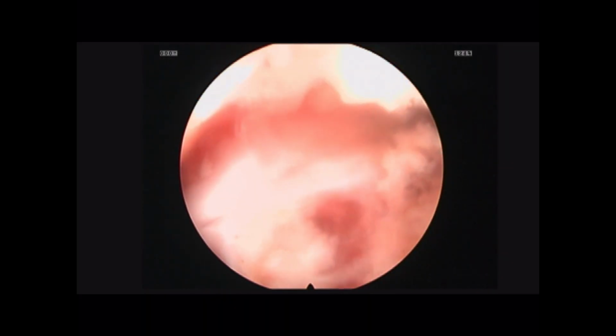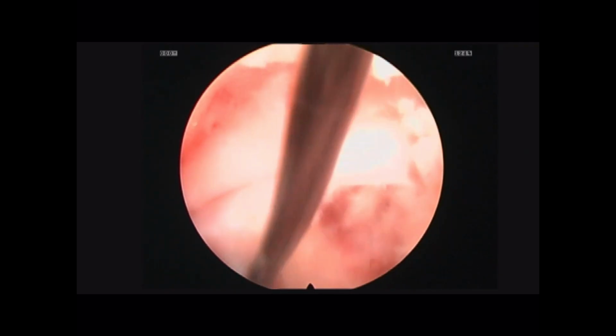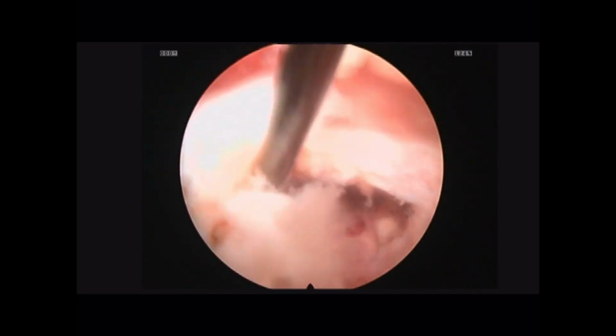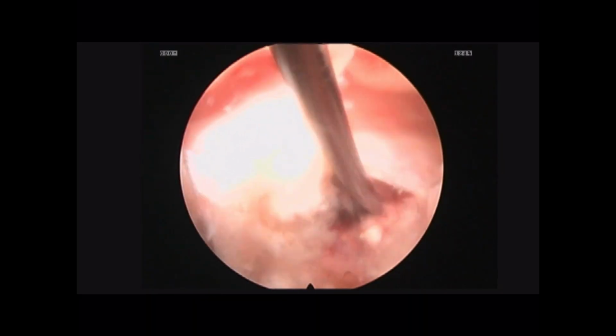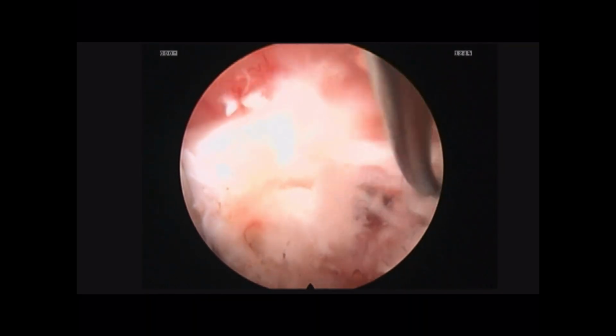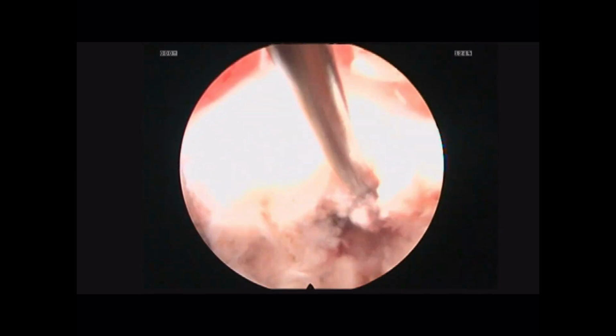We're able to dislodge herniated disc fragments, creating an easier opportunity to remove these pieces using our various graspers, which you saw in the first video. For a large portion of this procedure, we utilized a combination of the ball probe with the irrigation to help the fragments flow out from the existing port which we placed.